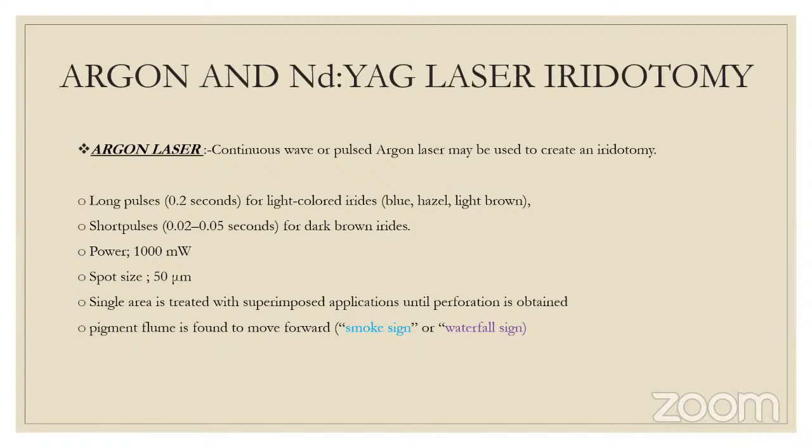So when do you use each for iridotomy? Normally, what is used? We don't use double frequency. We use the Nd:YAG laser.